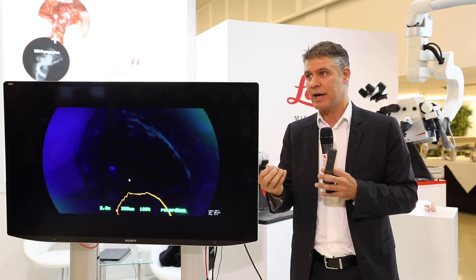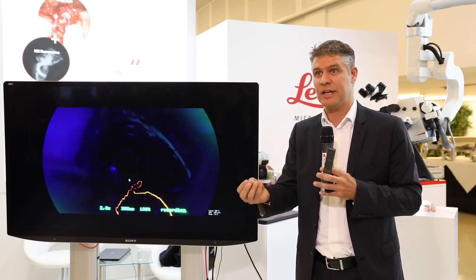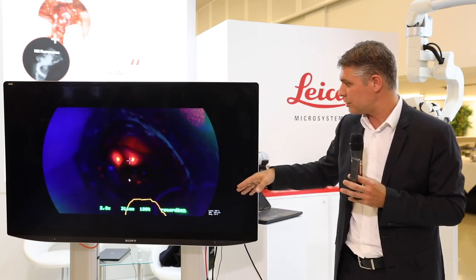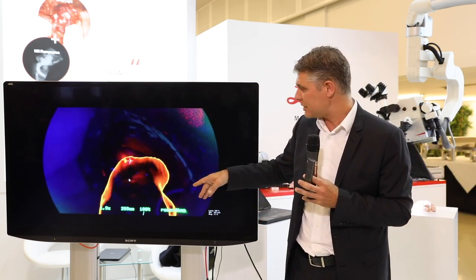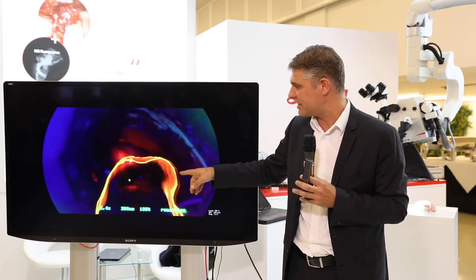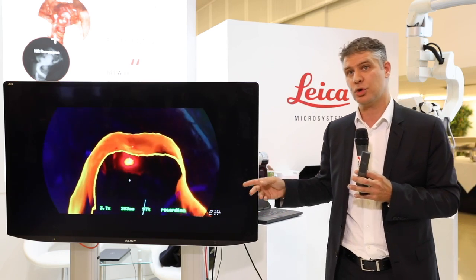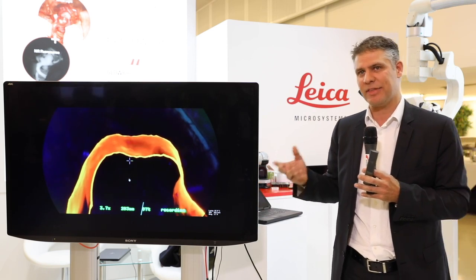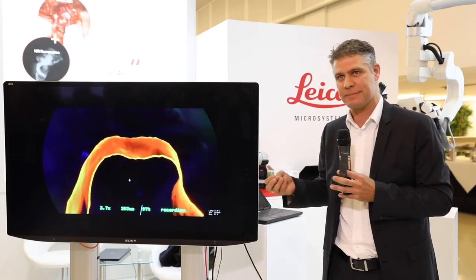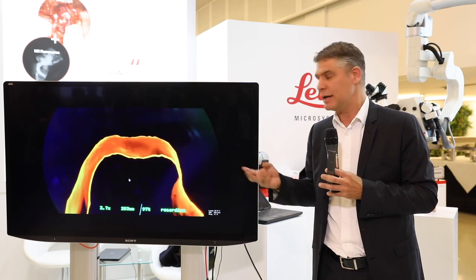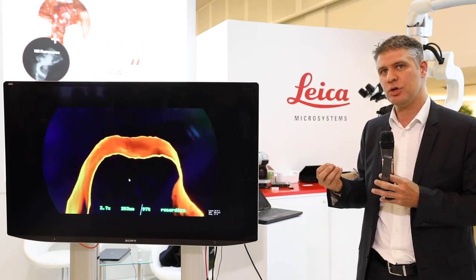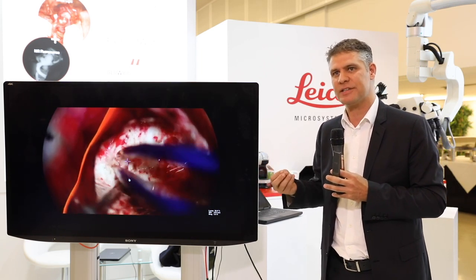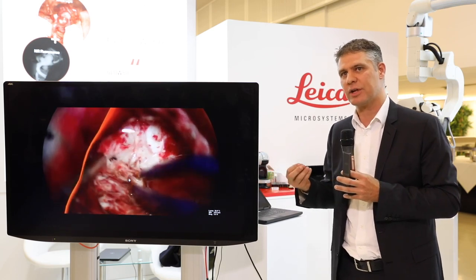When you know where the tumor should be, it's like finding a needle — if you know where to look, you find it. Then you switch to 5-ALA, and you see that the 5-ALA fluorescence is adjusted with the contour of the segmentation. I was quite surprised — I didn't think 5-ALA enhanced as precisely as contrast enhancement on imaging, but here it adjusts very well. We can even use the fluorescent signal to readjust the navigation, as long as the shape is perfectly the same.